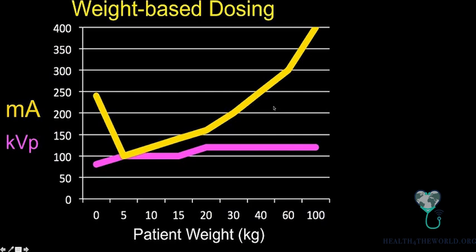Because if you put those doses into little babies, now you're talking about really high concentration of dose unnecessarily in terms of image quality. This is what we have found gives us enough image quality that we can stay diagnostic while minimizing the dose. We'll talk about how we've gone too far on the dose, and I'll show you examples of that.